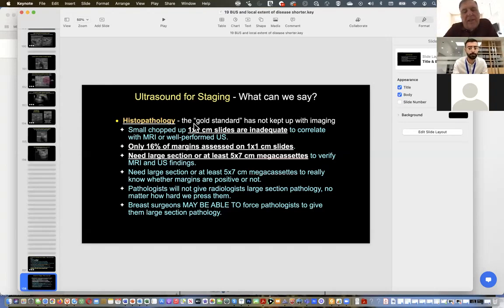Lymph nodes are something that can change very quickly in a matter of 6 to 8 weeks. I almost never do short interval ultrasound follow-ups at less than 6-month intervals. But for lymph nodes, I might give her 6 to 8 weeks to see if they regress at all. If they don't regress, I would core biopsy the most abnormal looking node, but I would give her 6 weeks, I think, just to see if they might just be reactive to the surgery.